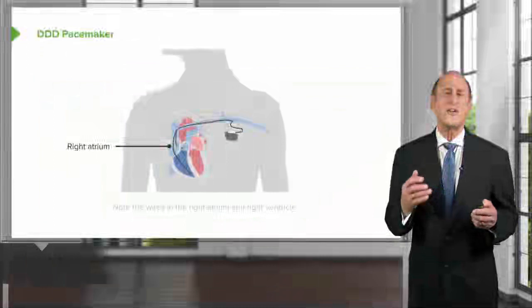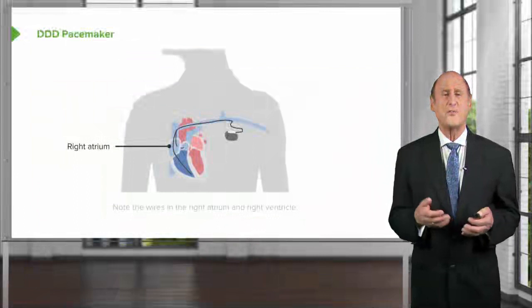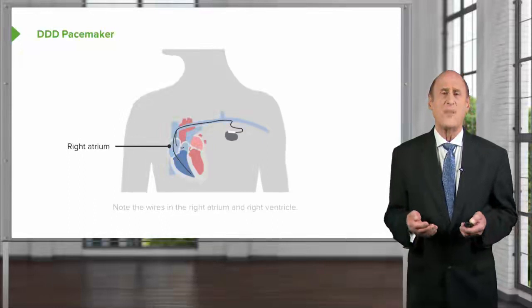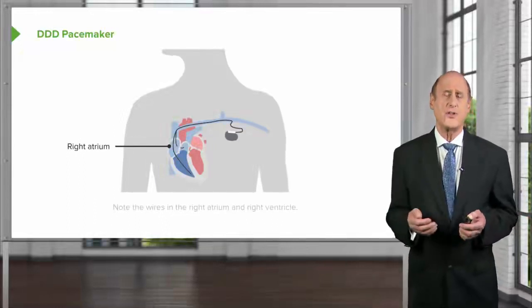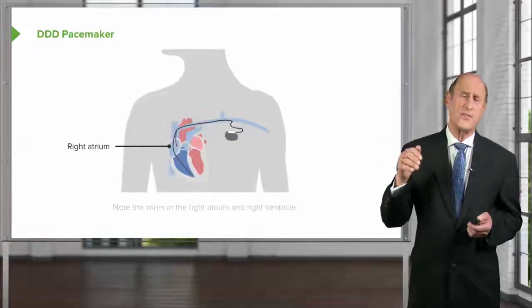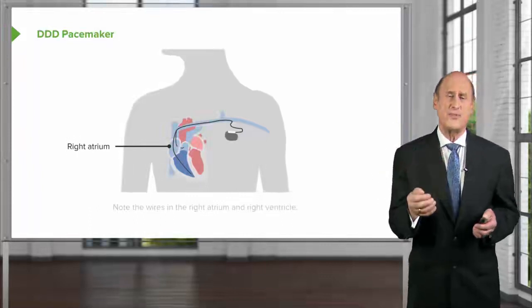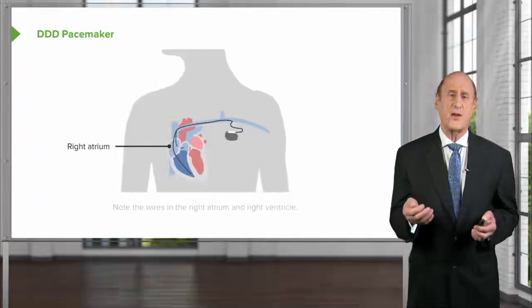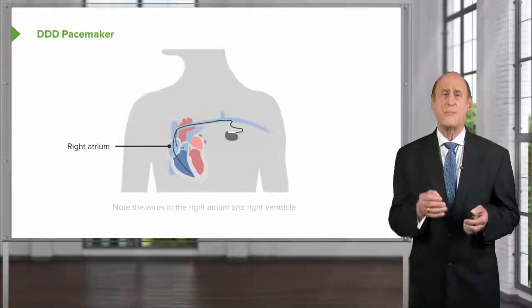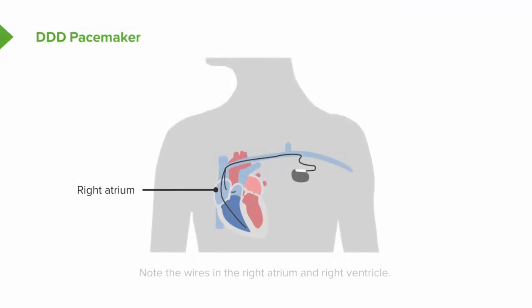In this slide, we see a little diagram, a little cartoon of how the pacemaker is inserted and where it's inserted. As you know, noted from earlier, it's almost always on the right-sided chambers. A wire is usually inserted through a catheter that's placed in one of the central veins, often the subclavian vein, percutaneously, that is with a needle, and the wire is then positioned. If it's a pacemaker that's in both the atrium and the ventricle, you have two wires, one put in the right atrium, one put in the ventricle, and that's what this little diagram shows. It shows a wire in the right atrium and a wire in the right ventricle.